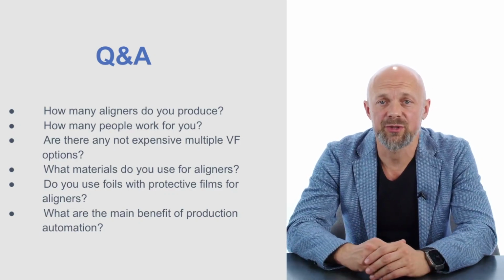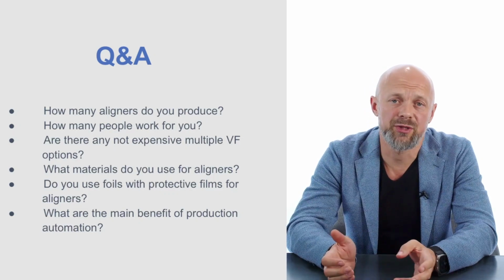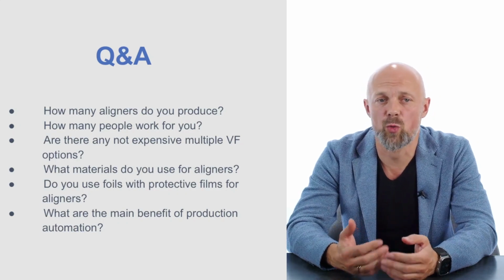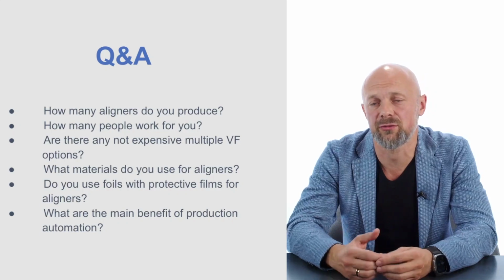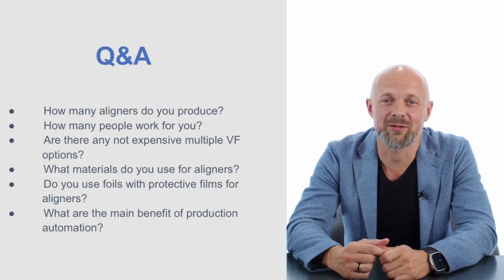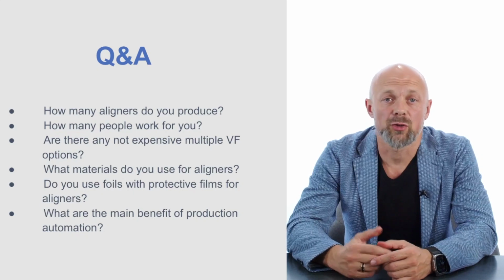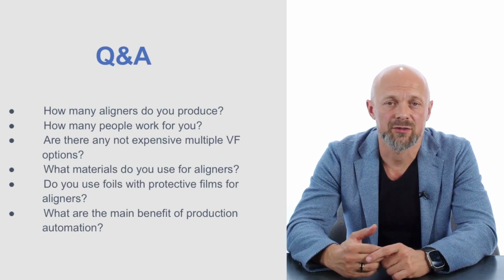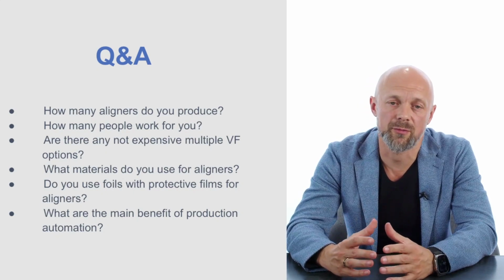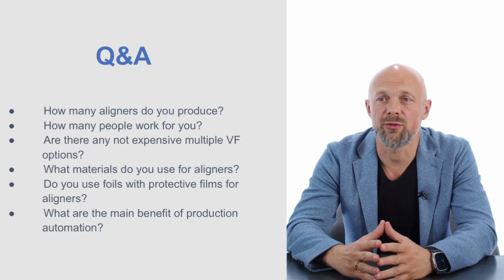This is my personal experience, and now we use Ministars because it's a pretty simple device which works very well with massive manufacturing. So you just need 10 Ministars. That's it. As I know and as I saw at IDS, Forestadent also manufactures and produces multiple vacuum form devices, but I didn't test it, so no experience.